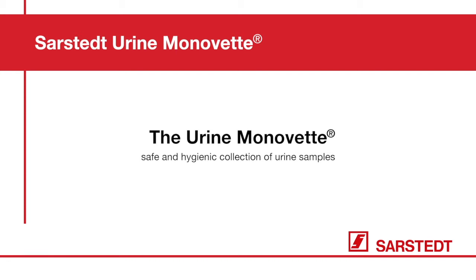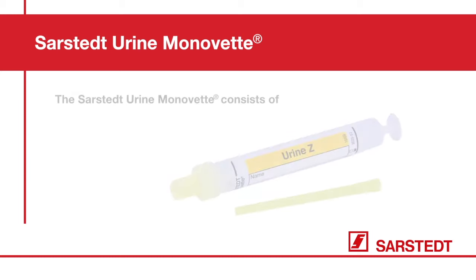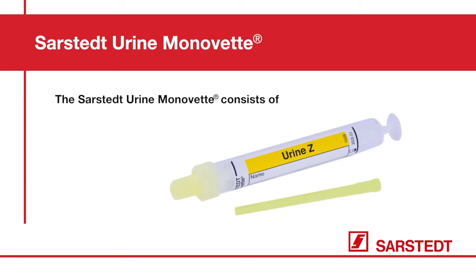The Sarstedt Urine Monovette — safe and hygienic collection of urine samples. The Sarstedt Urine Monovette consists of one urine Monovette collection tube, one plastic straw, and one stopper.